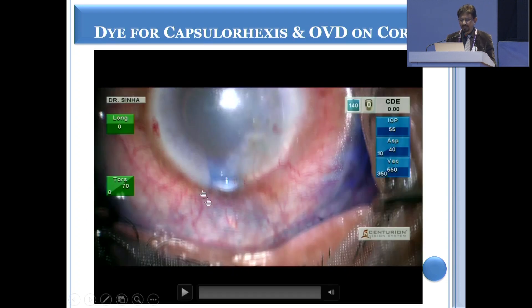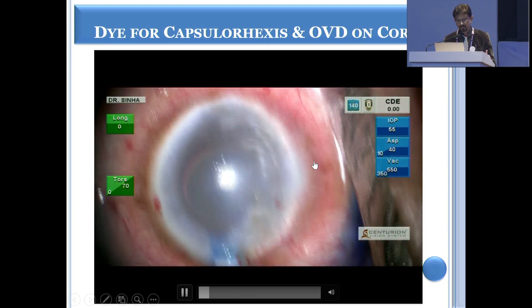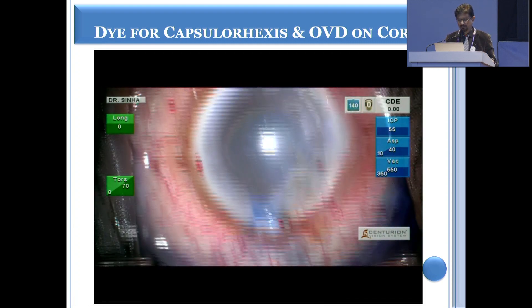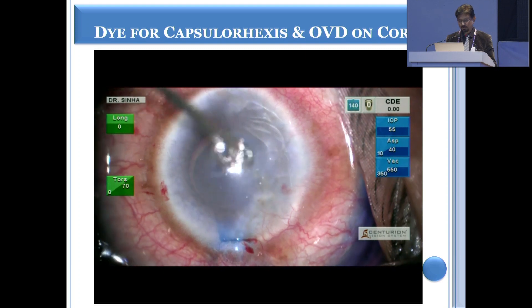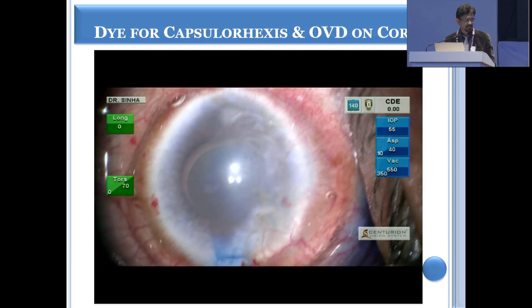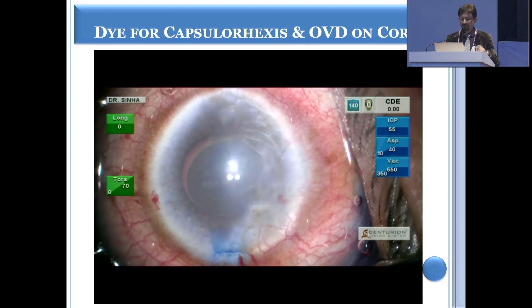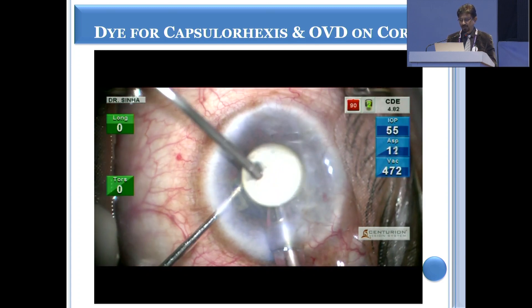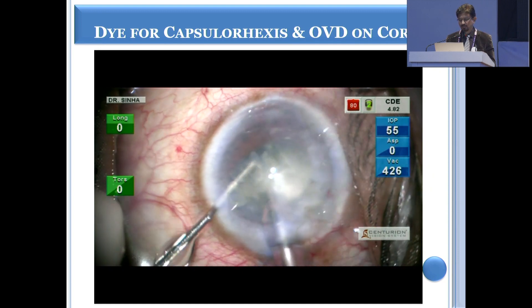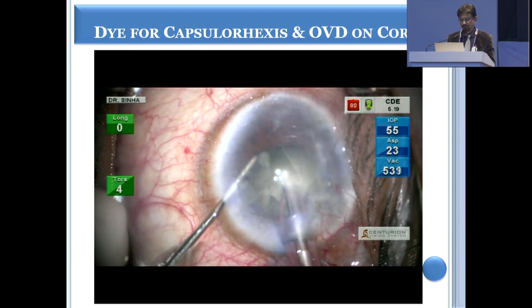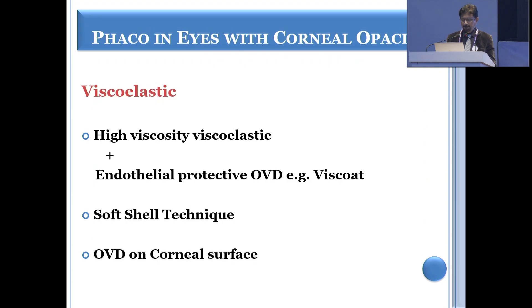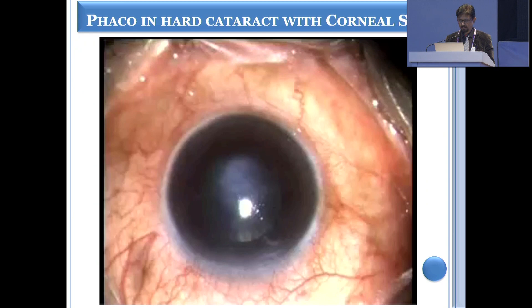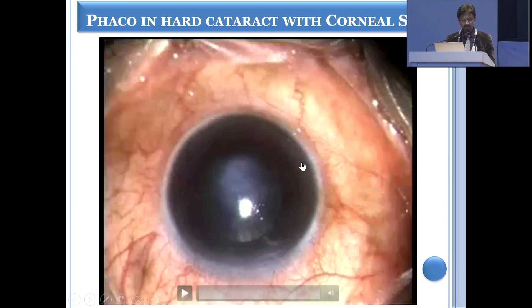Another important thing is that you can use viscoelastic inside the anterior chamber, which can coat the endothelium. You should also use visco-dispersive viscoelastic on the surface of the cornea, so that it increases visualization. Whenever you are doing some manipulation, such as a chopping technique, put a blob of viscoelastic on the cornea and that clears up the visibility and improves it significantly. Good quality viscoelastic is essential not only over the surface, but inside the eye to coat the endothelium.